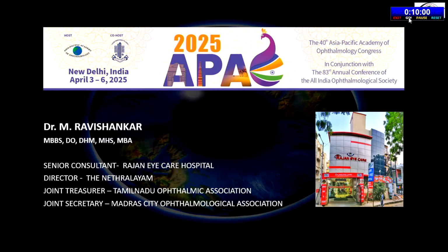Actually, if you ask the posterior segment surgeons, if you say anterior segment surgeon, just remove the vitreous from the anterior chamber in the pupillary area, just go a little behind the pupil as well. As I told you in my presentation, I don't know whether you were there when I talked. Yes, use Tricot. Use Tricot first. As soon as you have a PCR, put Tricot first. Delineate the vitreous. Remove the vitreous first. Use a high cutting rate with suction of about 150-200 millimeters. All the phaco machines are now equipped with vitrectomy cutters. 23 gauge cutters are available.